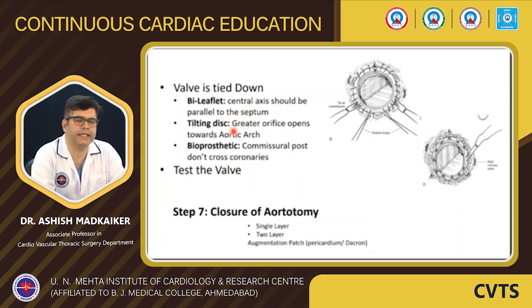When it is a tilting disc valve, we should see that the greater orifice opens towards the aortic arch. And when it is a bioprosthetic valve, we should see that there is commissural alignment of the new valve with the native aortic commissures, so that we don't cause any obstruction to the coronary blood flow.